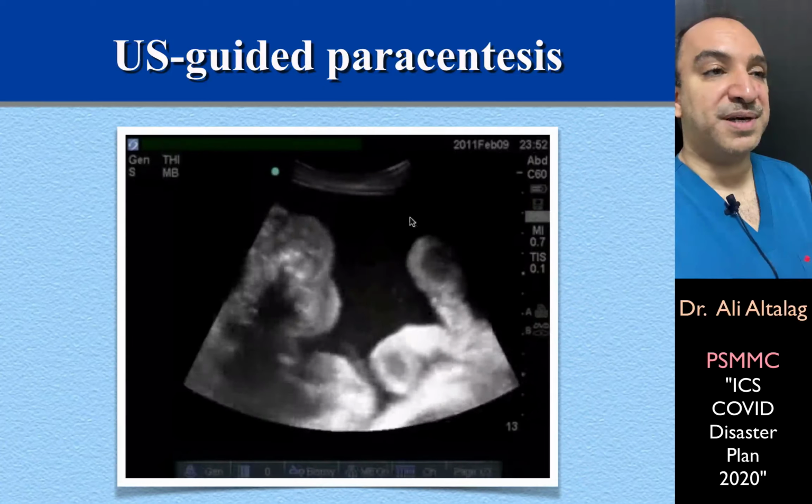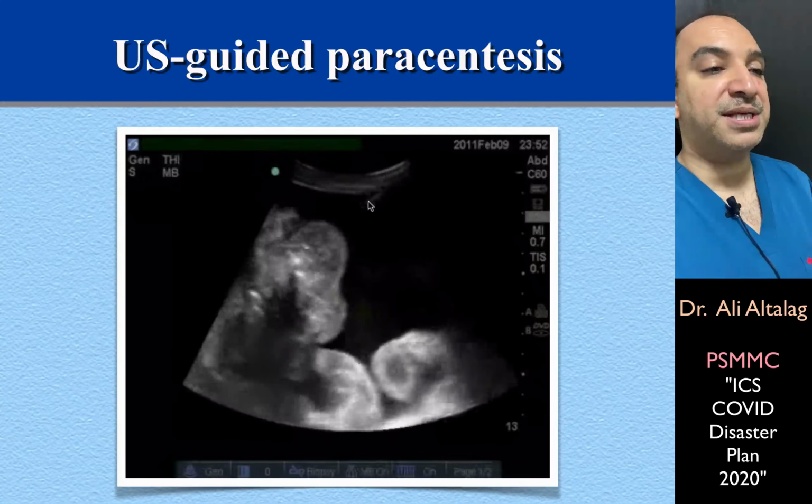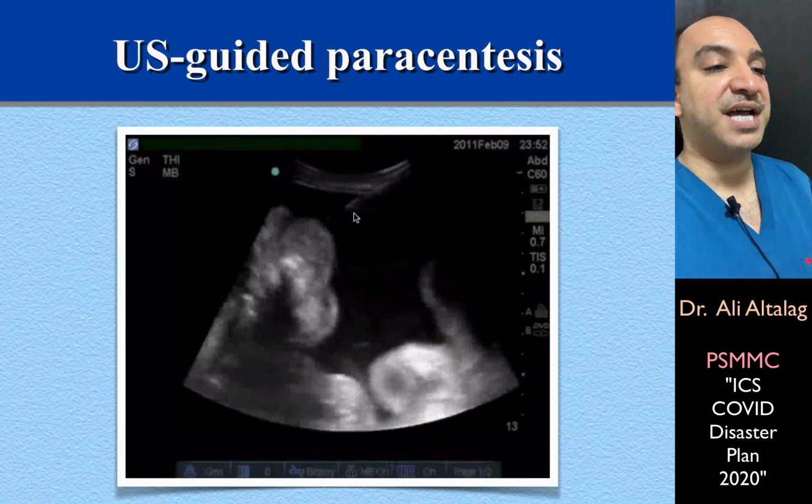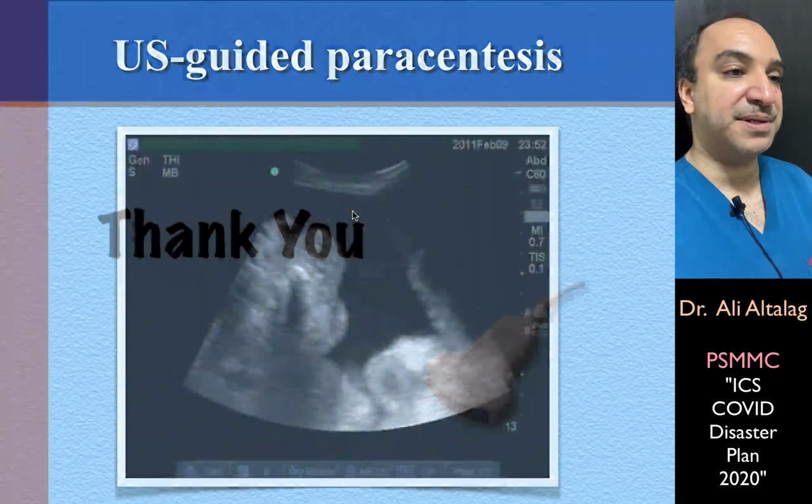And this is how we do paracentesis, ultrasound guided. You see the needle going in, then the needle went out, and what remains is the cannula, and then we can aspirate fluid for either analysis or for therapeutic purposes.